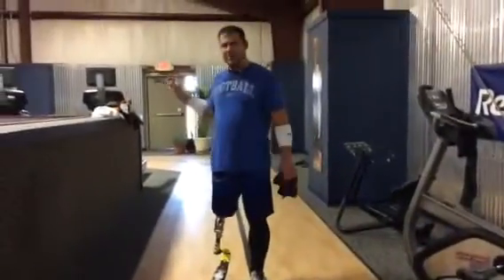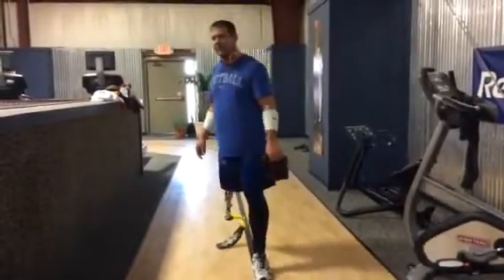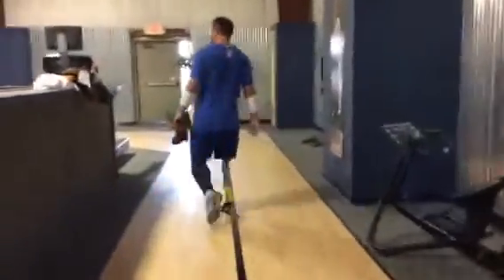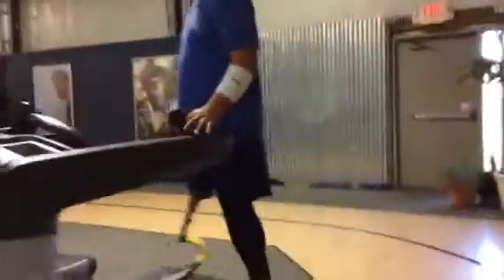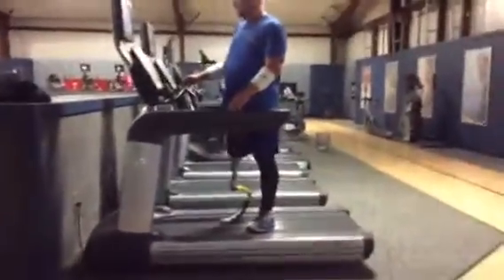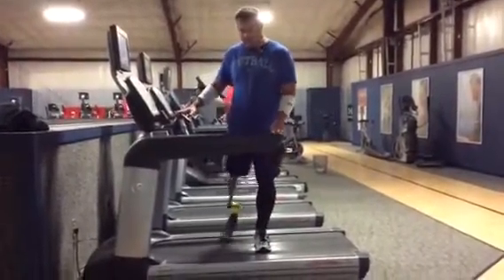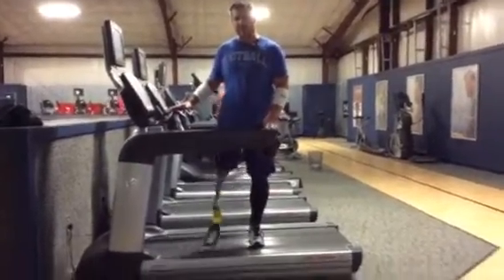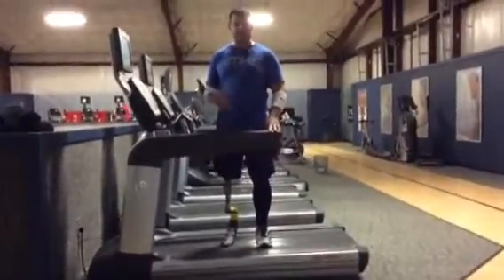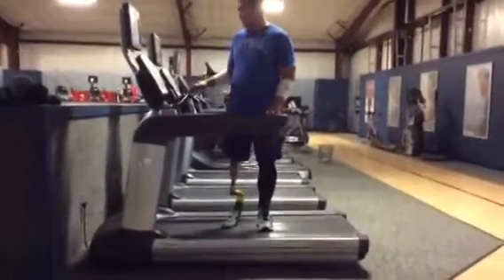So we're going to look at this on the treadmill real quick and see how it looks as you start to build up speed. You're just going to be taking your leg, it's going to stay stiff, and you're going to use your hip to move it out to the side. It takes a lot less energy than normal running, but you don't get quite the same amount of speed.